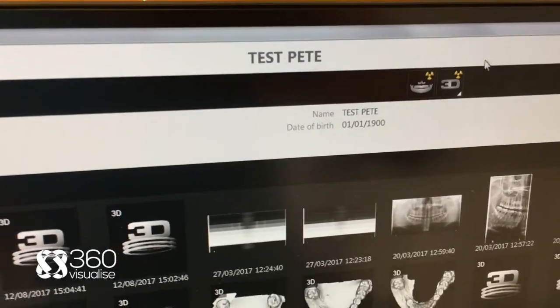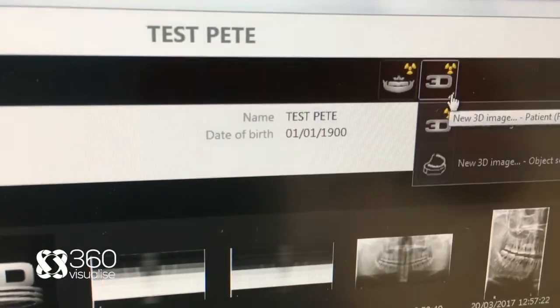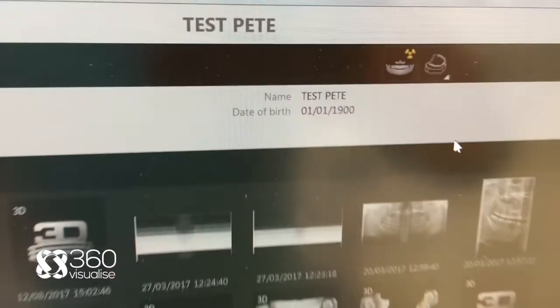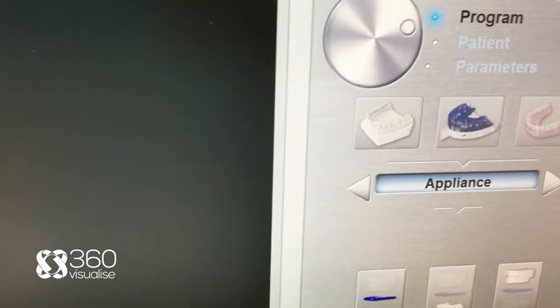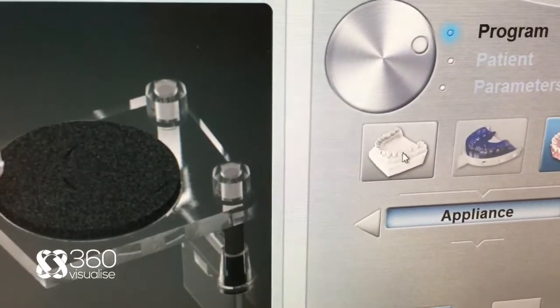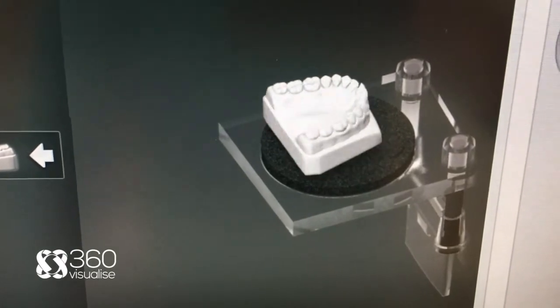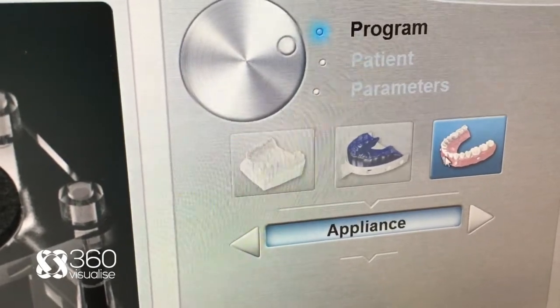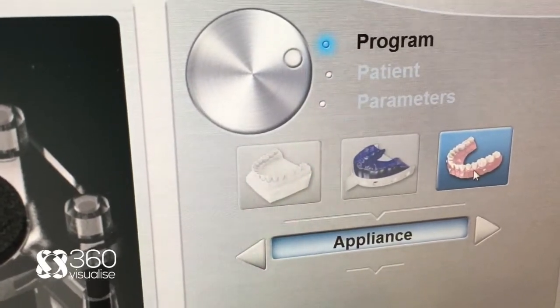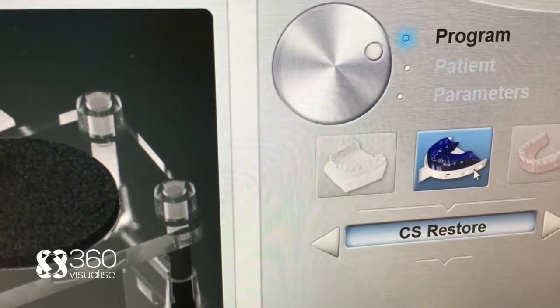The setup is very easy. On the software here, you go into your patient. On the 3D acquisition, you click on this little triangle here, which is new 3D objects. Open up the acquisition window, and then you choose the appliance. What we've got here is a clay model, and it shows you on the graphic there how to insert it in the machine. You've got denture with opaque markers. What we're going to do here is an impression.